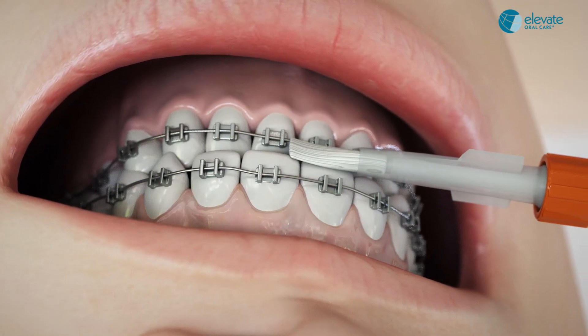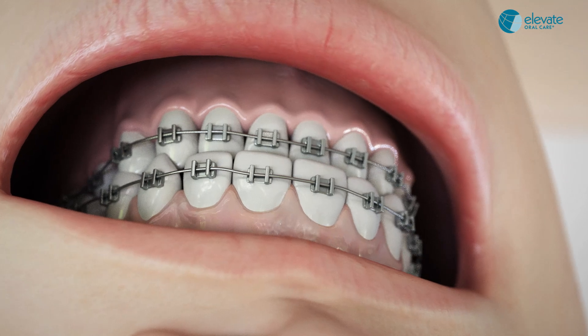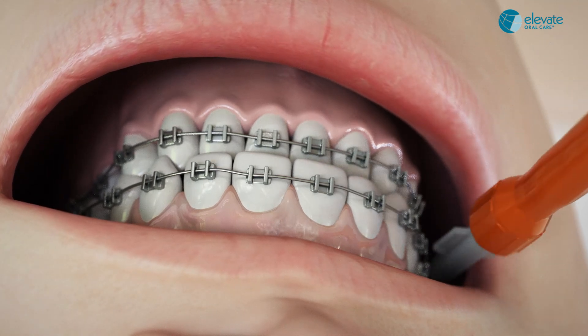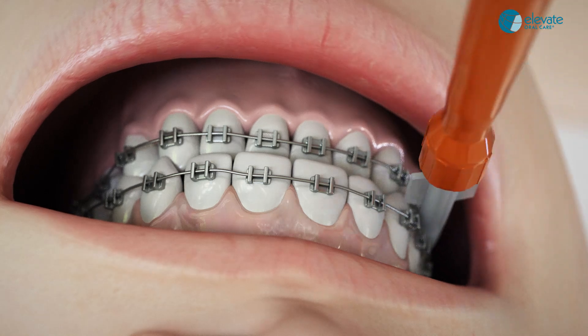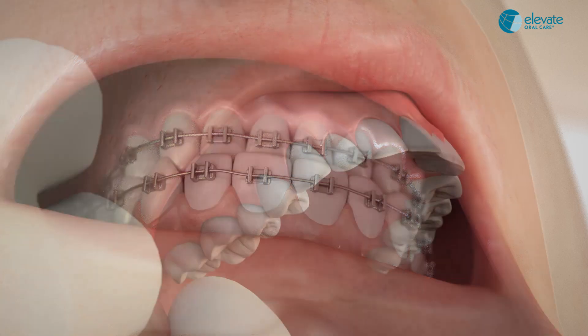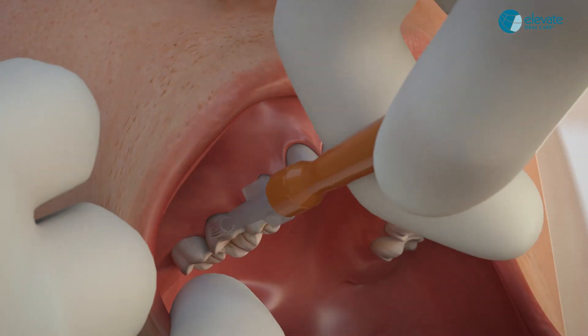For pediatric and orthodontic patients, have the patient bite together and paint one quick swipe on the bite line of the facial surfaces from posterior to anterior, allowing the bristles to touch both upper and lower teeth of the mouth.